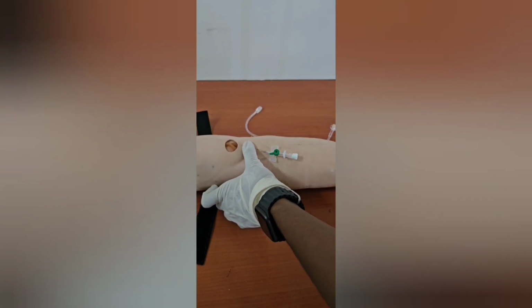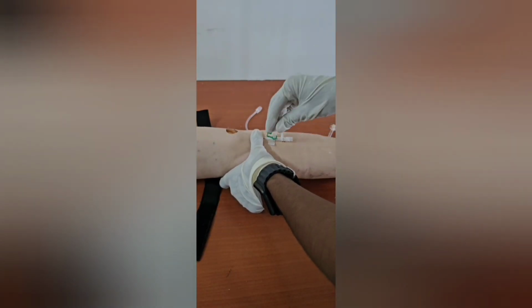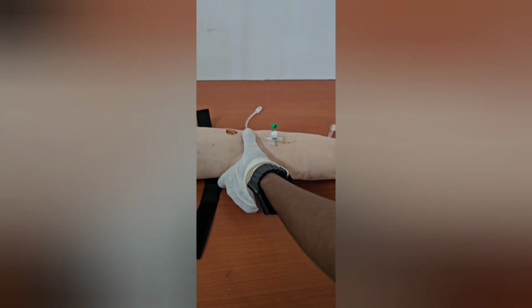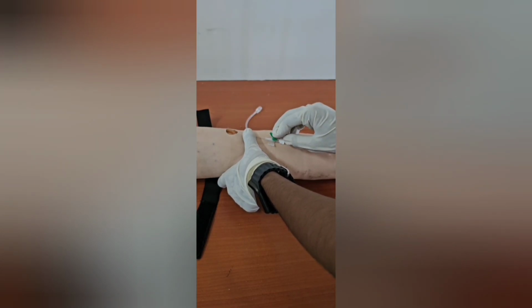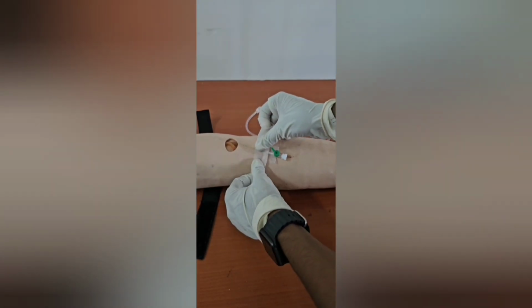Make sure the Venflon is stable at all times. Then stabilize the Venflon using a micropore tape.